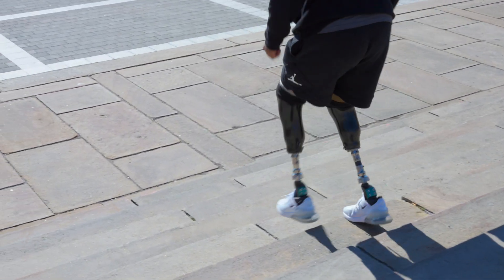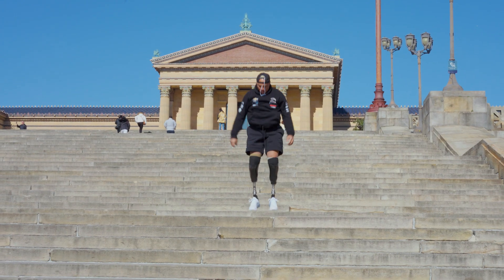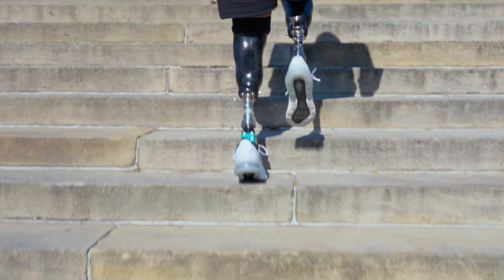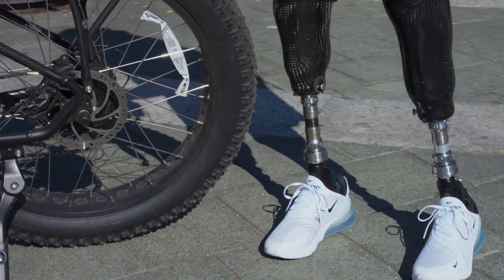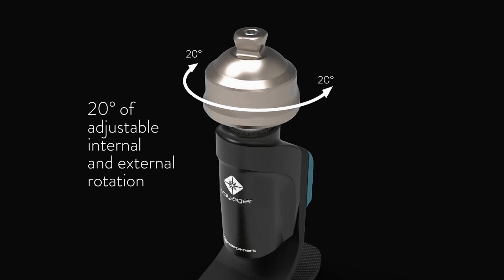The Voyager allows for up to 10 millimeters of vertical shock absorption, which may reduce impact and pressure on your body. Made of titanium and stainless steel, the adjustable built-in torsion unit offers a maximum of 20 degrees of internal and external rotation.